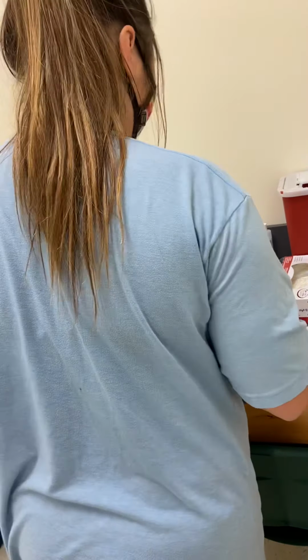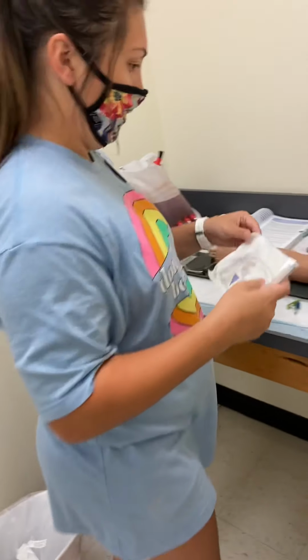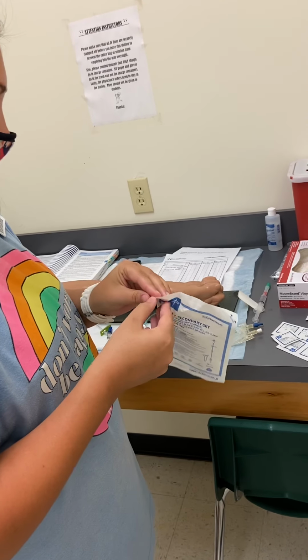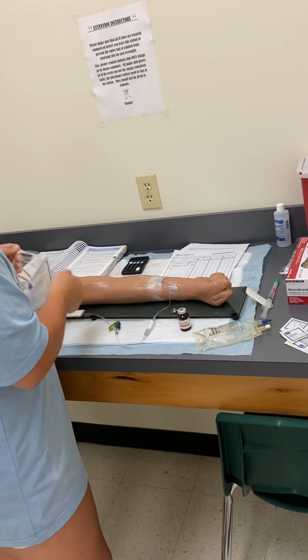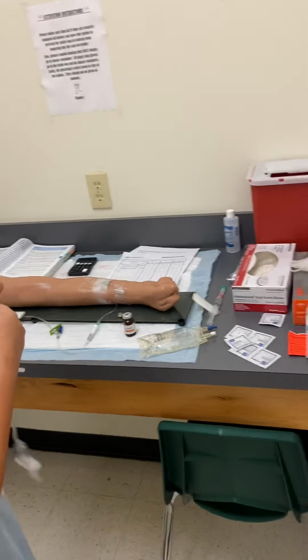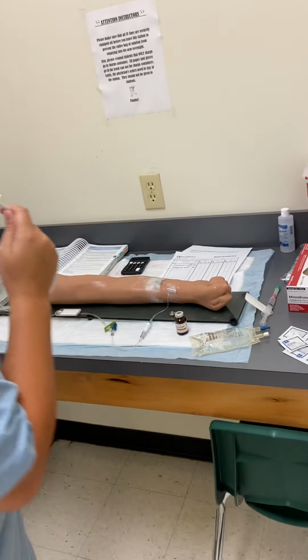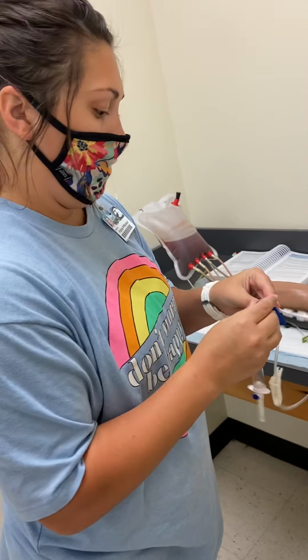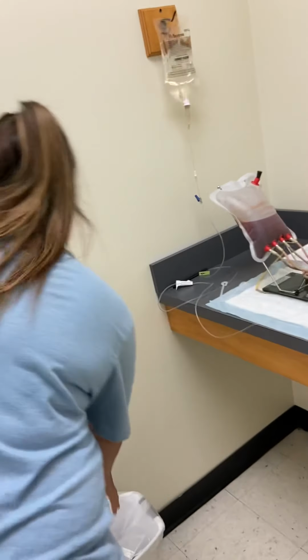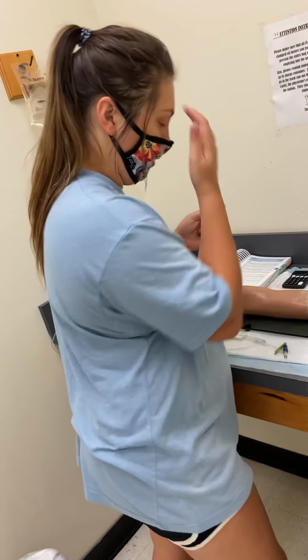Alright, so there's that. I'm also going to go ahead and do my prime for my piggyback. Go ahead and clamp it. Keep those air bubbles out. Alright. I'm keeping the cap on so I don't contaminate.